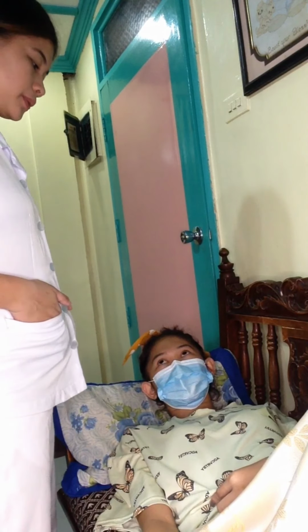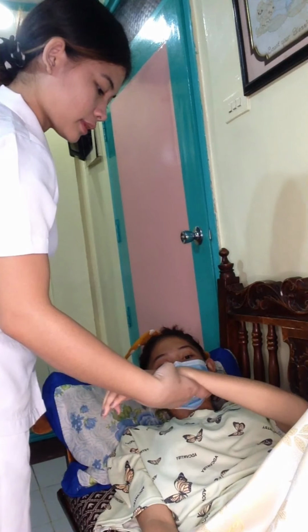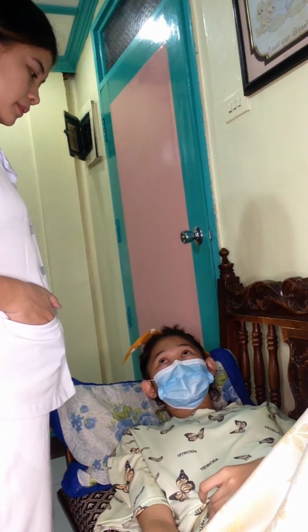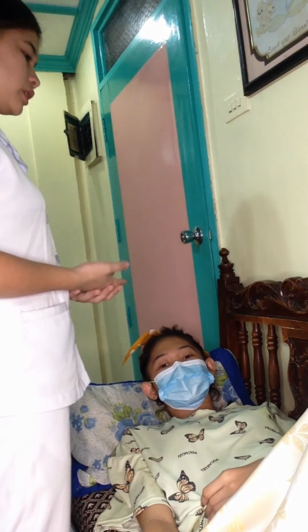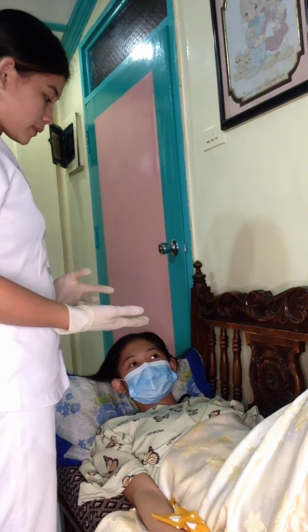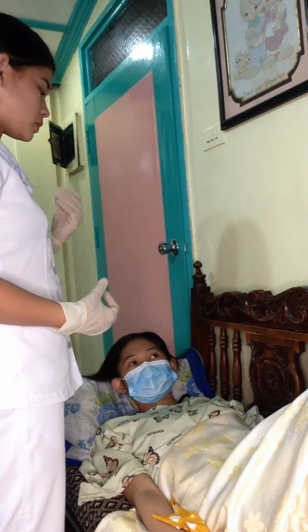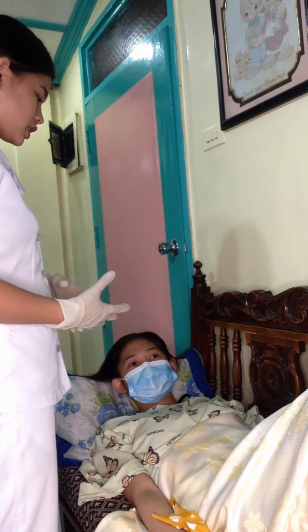Your birth date po? May 20, 2007. I will check your wristband, ma'am. Thank you, ma'am. What would you like me to call you? Irish. Okay. Hello, ma'am Irish. Today, ma'am, I'll be going to insert a catheter. Is that alright? Yes. Okay, ma'am, we can speak in Bisaya, Tagalog, or English.